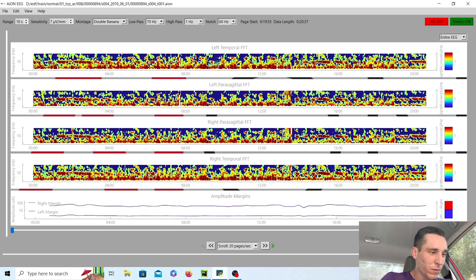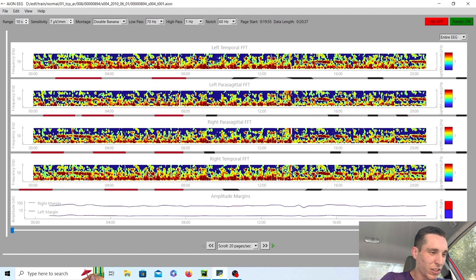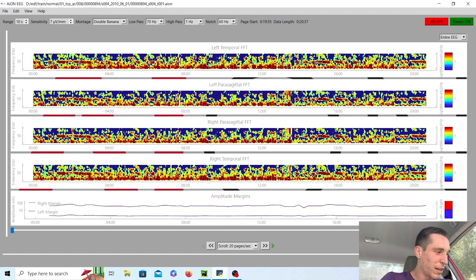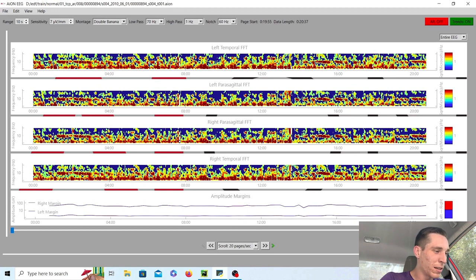And as they drift off to sleep, we can see a little bit higher than 10, more at like 13, you can see the sleep spindles. It's definitely higher than down here at nine, where you had the awake background, you start to see the sleep spindles right here, a little bit higher.